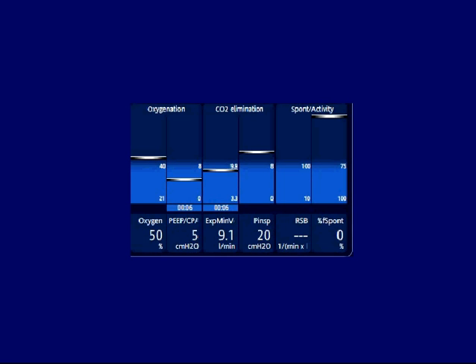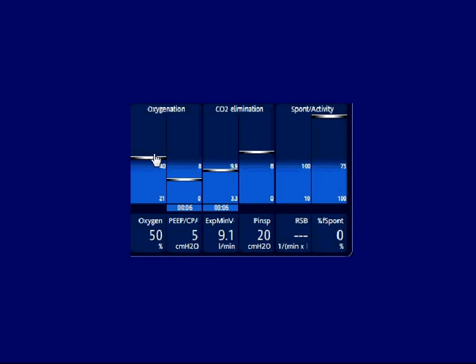Here's a vent status example indicating a patient that needs high ventilatory support, as shown by the bars being out of the weaning area. The patient is not spontaneously breathing at all, so they need the ventilator. Additionally, they're on a high amount of pressure and their oxygen is not within limits yet.